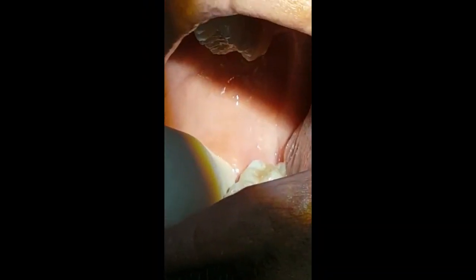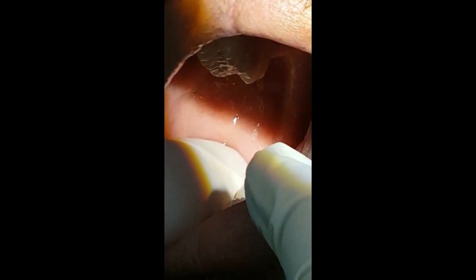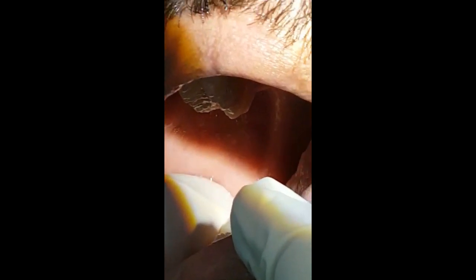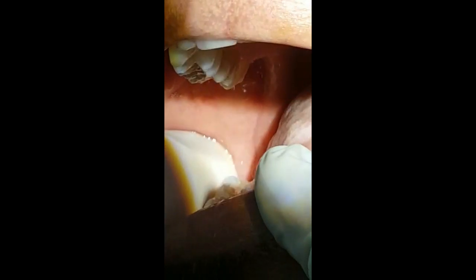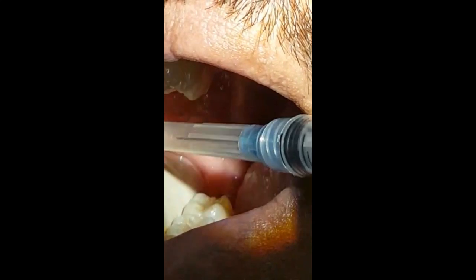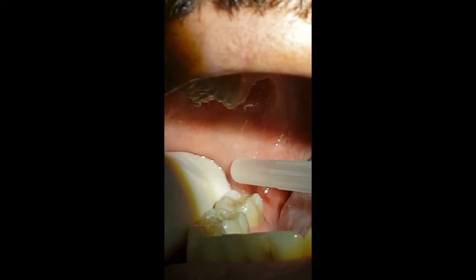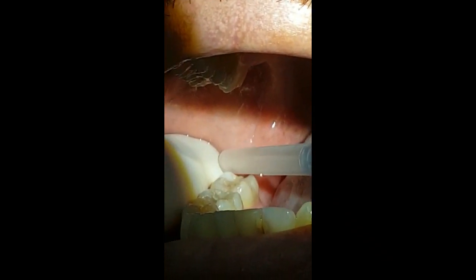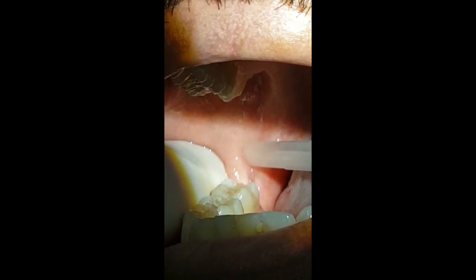The first thing you need to do in an inferior alveolar nerve block is feel for the coronoid notch. The coronoid notch is the deepest portion on the anterior border of the ramus. In the classical inferior alveolar nerve block, you come from the opposite side — this is the pterygomandibular raphe — and the line comes from the center of the thumb up to the raphe. This is the point of entry.